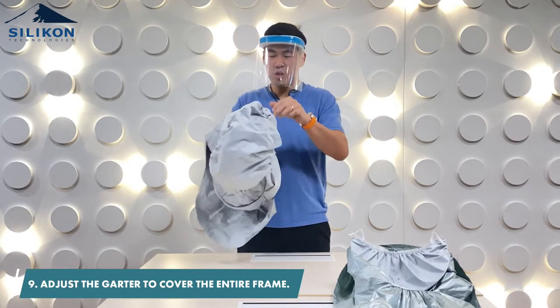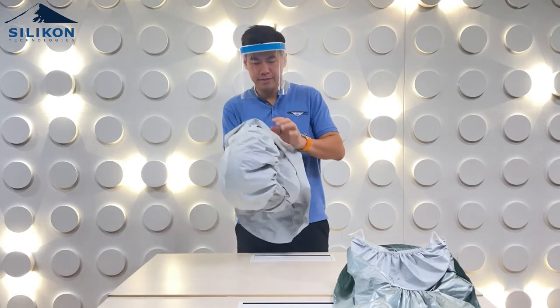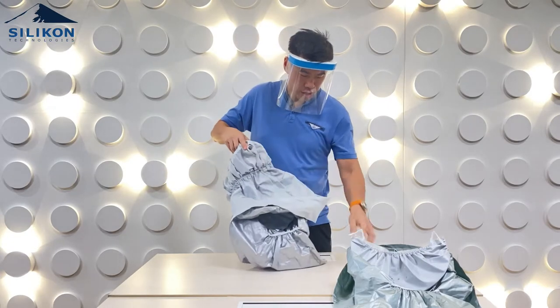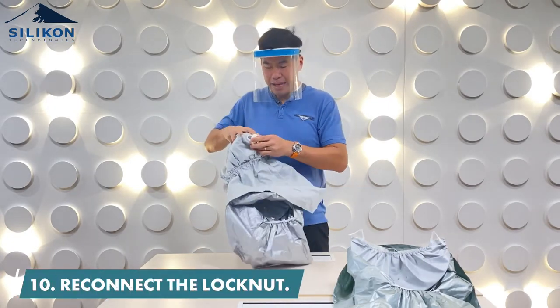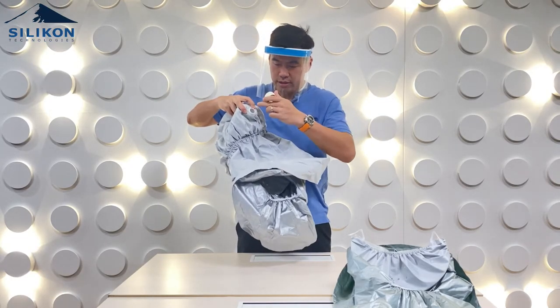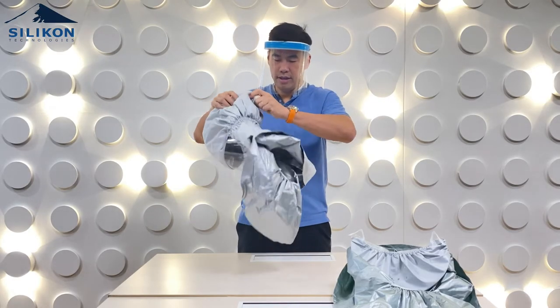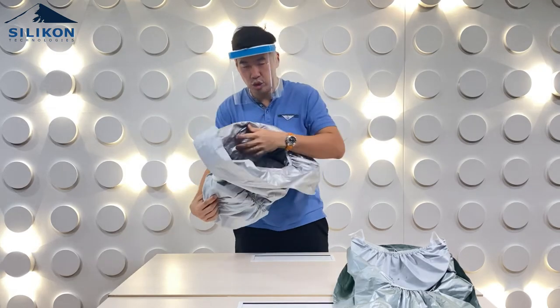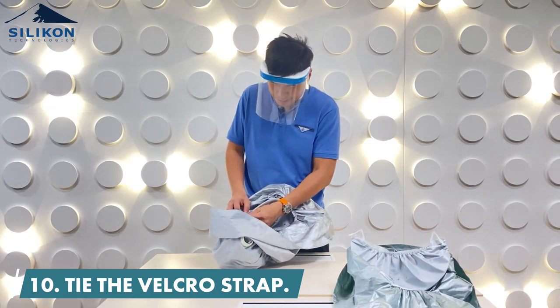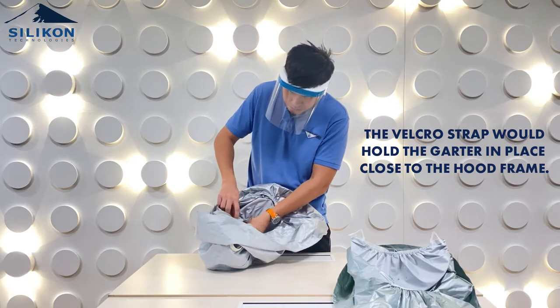The garter has to cover the hood frame completely. Once it's covered, connect the lock nut back in. Make sure there's a hole on the hood and that it's properly fixed, then connect the lock nut. Once you're done with that, don't forget to also tie in the velcro strap — the velcro strap holds the garter in place close to the hood frame.